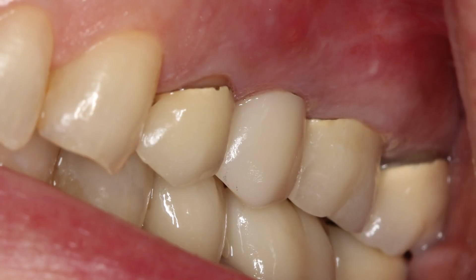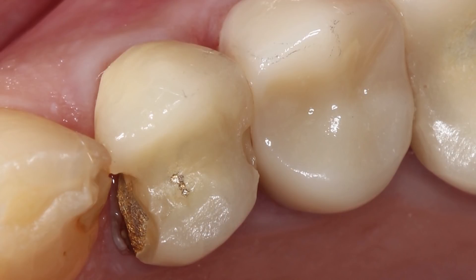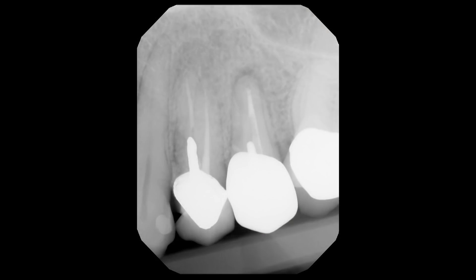The following case presentation illustrates the diagnosis, planning, and treatment for the extraction of maxillary left first and second bicuspids with the immediate placement of the Han tapered implants from Glidewell Direct. Here we have a 61-year-old female who presented to the practice with symptomatic maxillary left first and second bicuspids with failing endodontic treatment. The porcelain of the old PFM, porcelain-fused metal crowns, had fractured, and endodontic evaluation indicated fractures and a poor prognosis for further treatment of the teeth.